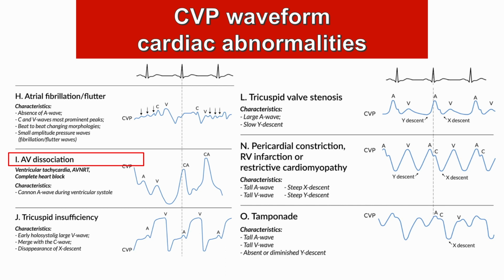because our tricuspid valve is open when the ventricle contracts, and you get this backflow, and obviously that backflow creates more pressure in the SVC, and you're going to have an amplified wave. Obviously, it's going to be irregular as well.